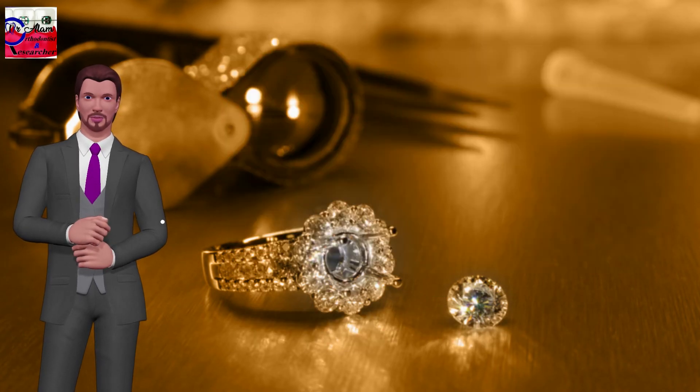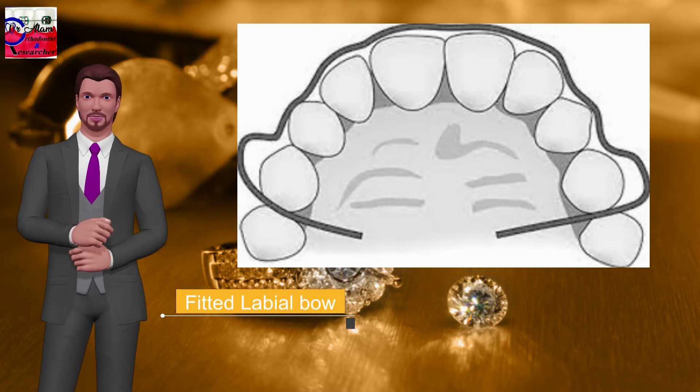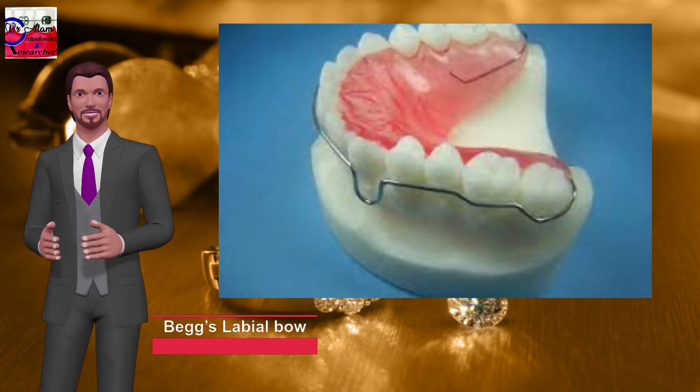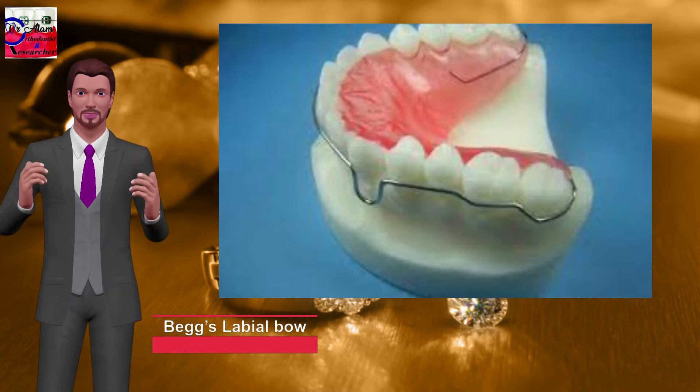Fitted labial bow: used as a retention appliance after fixed orthodontic treatment. Begg's labial bow: introduced by P.R. Begg, also known as Begg's wrap-around retainer or around-the-globe bow. Also used as a retention appliance after fixed orthodontic treatment.